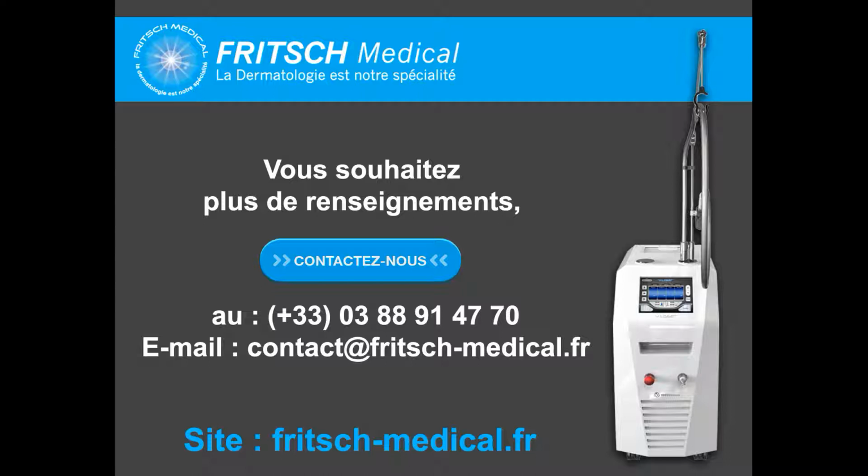For the face, the diffusion of the thermal effect is completely different. So you can proceed with more power, maybe fewer degrees, but my favorite is always 5 degrees because you have no risk. But if you wait too much with 5 degrees, you induce a vasoconstriction. So the purpose is not to wait too long with one piece. That's the reason I prefer to wait longer after the shot than before.